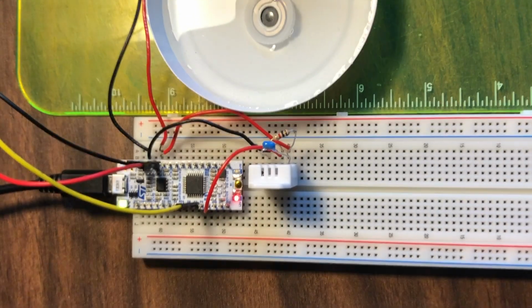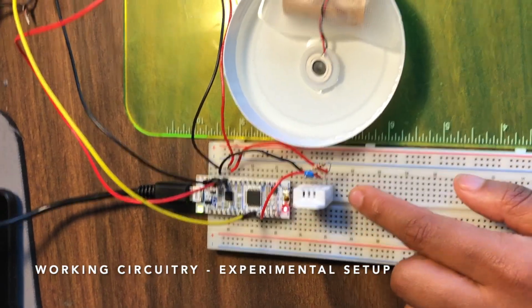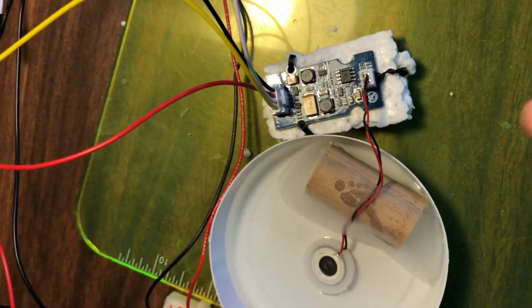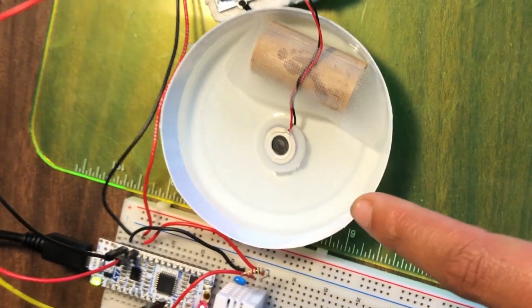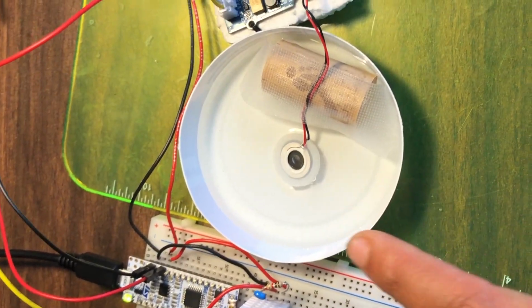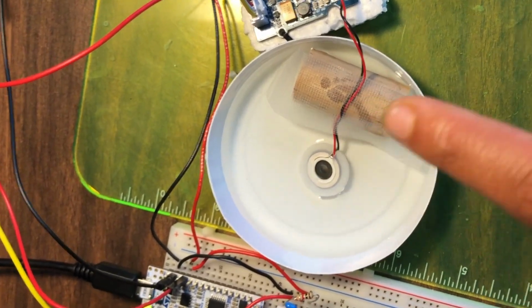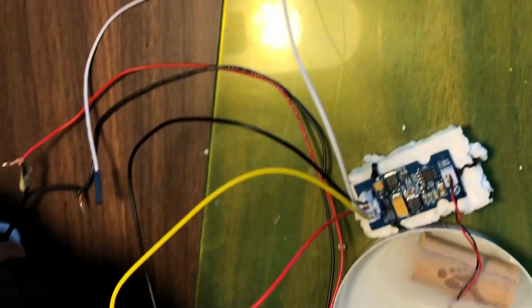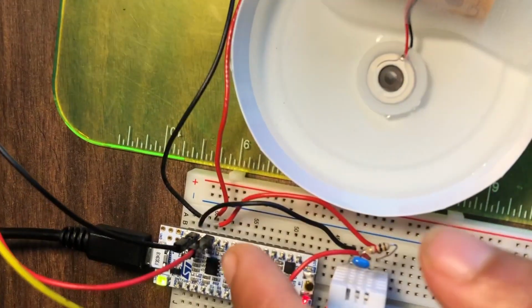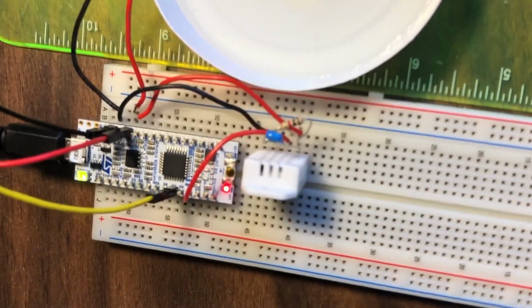Okay, here I have my experimental setup with my microcontroller, the sensor, and my Grove Atomizer humidifier. So we have the transducer in this cup of water, which then produces the water vapor, which is producing higher humidity when on. So the driver board here requires a 5-volt input, which is what we have here. And this is connected to the 5-volt pin of the microcontroller, as well as the ground pin of the microcontroller.